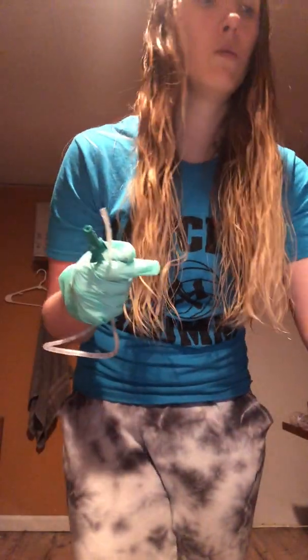Once we have our gloves on and everything, we're going to set up the rest of the equipment in the suction catheter kit. I'm going to use my non-dominant hand and set up my little basin. I'm then going to pour that sterile water into that basin. The outside of that basin now is non-sterile, and the inside is still sterile.